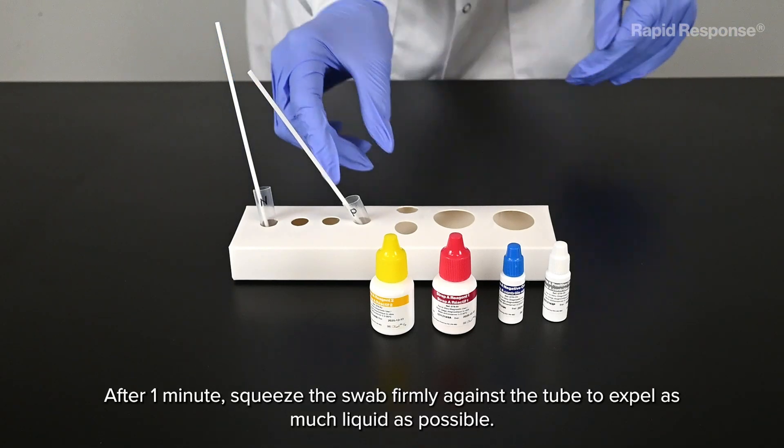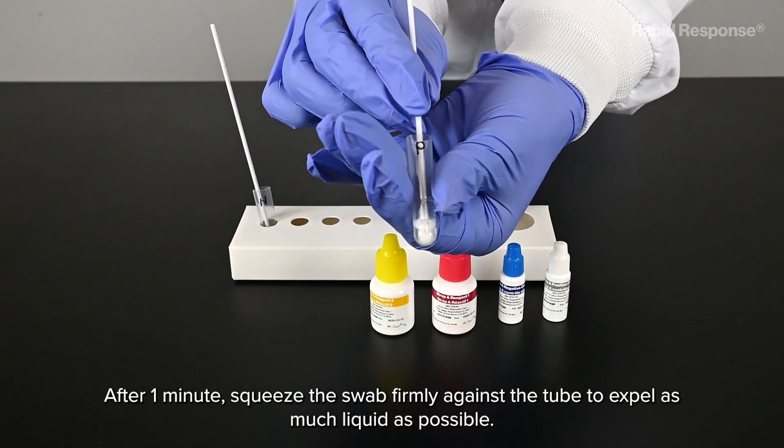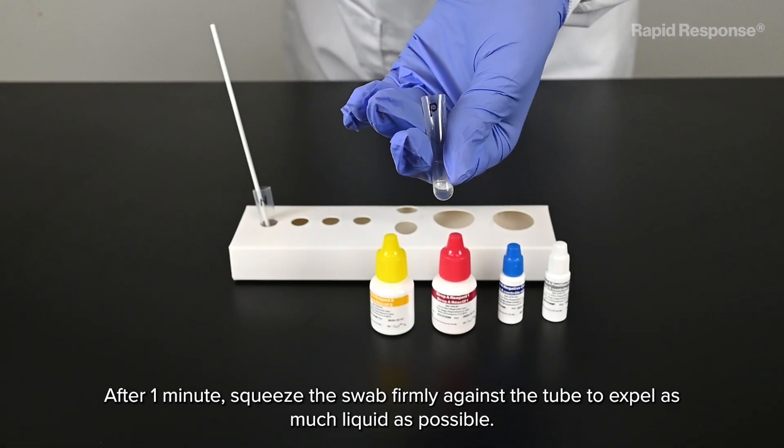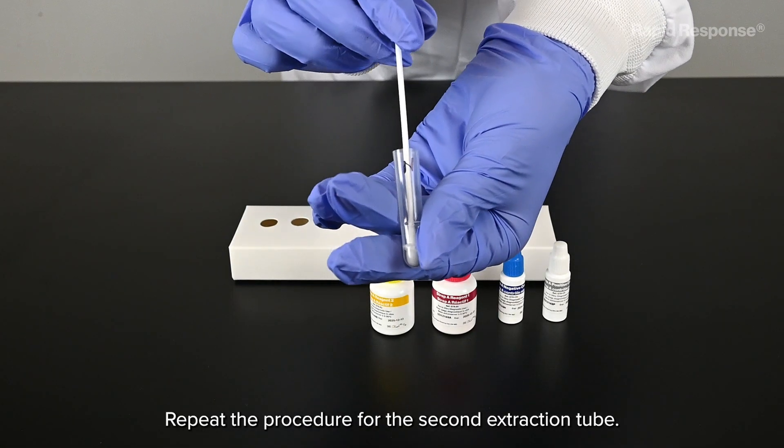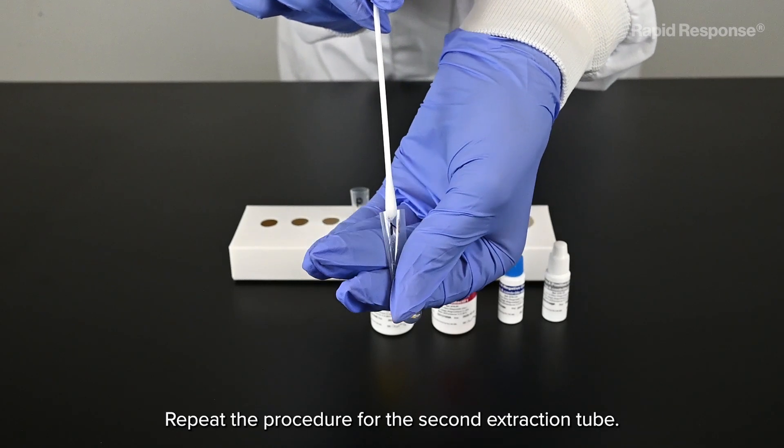After one minute, squeeze the swab firmly against the tube to expel as much liquid as possible. Discard the swab. Repeat the procedure for the second extraction tube.